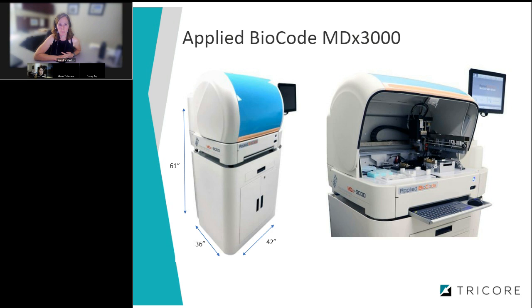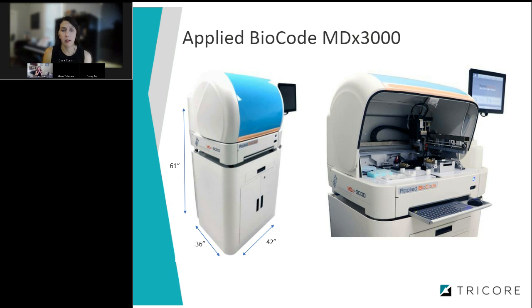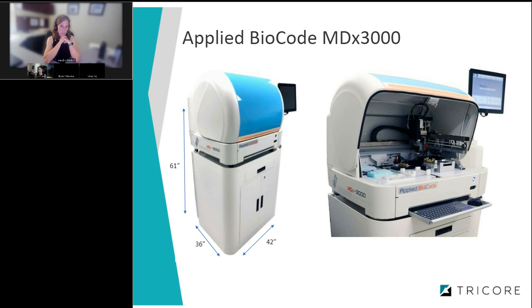And did your lab validate other extraction methods for use with the MDX 3000? No, it's fine. We didn't validate any off-label extraction platforms, but we did validate both of the extraction platforms that are on label, so the MagnaPure 96 and the EasyMag.